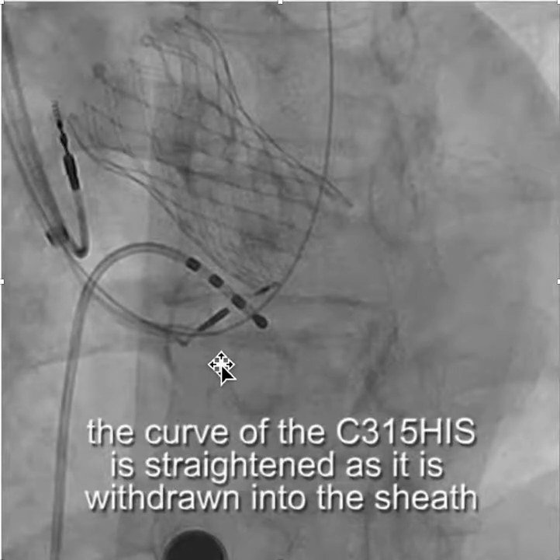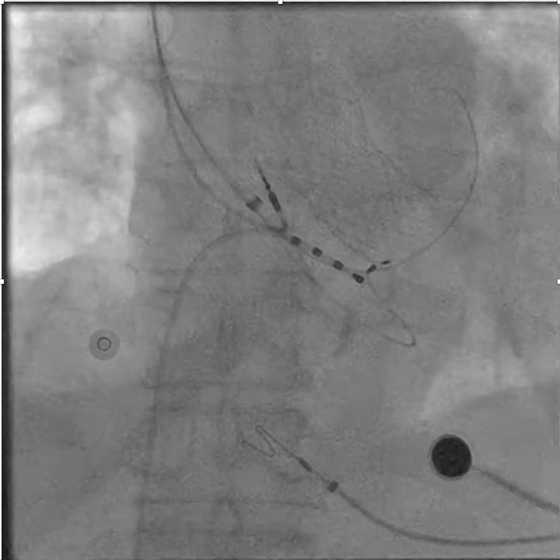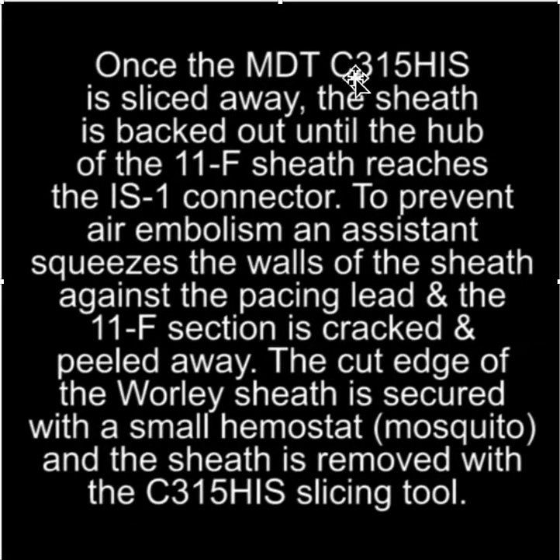One of the nice parts about this setup is that when you go to remove the C315 HIS, oftentimes the curve causes lead dislodgement as it passes through the atrium. When using a long sheath, the C315 HIS is pulled into the sheath and straightened out as it is withdrawn. Once the C315 is removed and sliced away, the sheath is backed out until the hub of the 11-French sheath reaches the IS-1 connector on the 3830 lead.